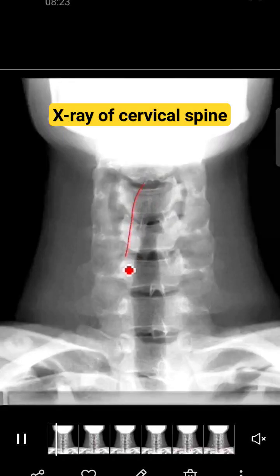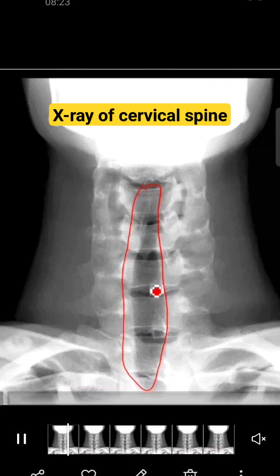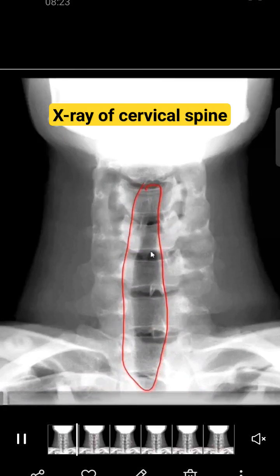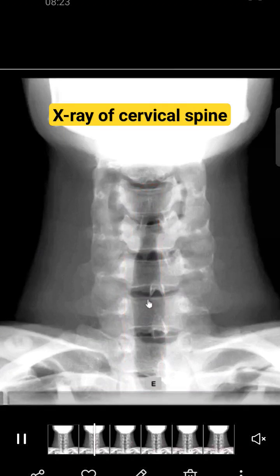This is the X-ray of the cervical spine. Here you have the first question: identify this black longitudinal shadow. My dear students, this is the shadow of the trachea — as you know, it contains air. The second question comes about identification of these side-placed projections.